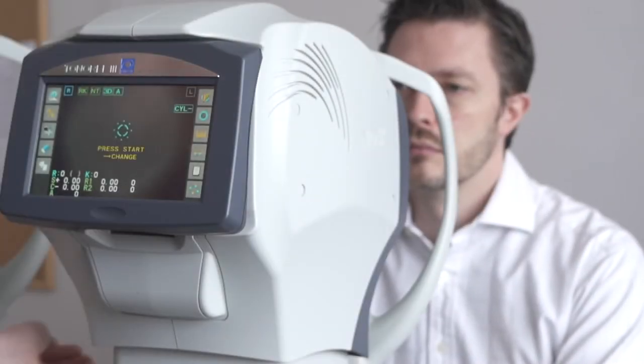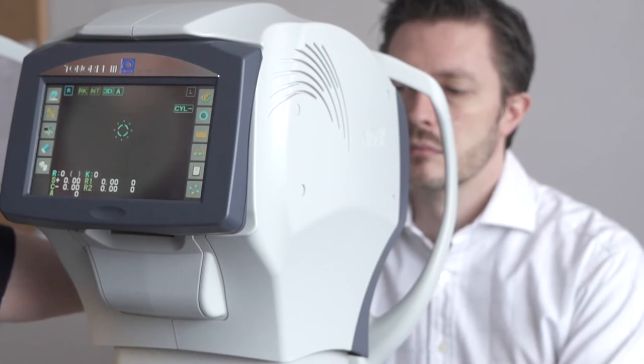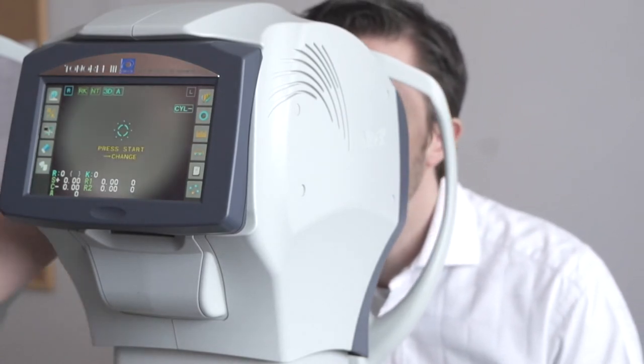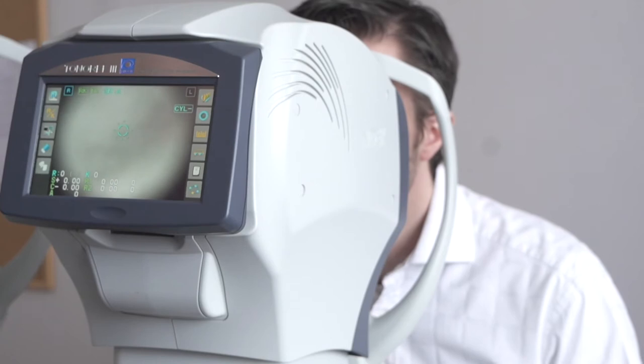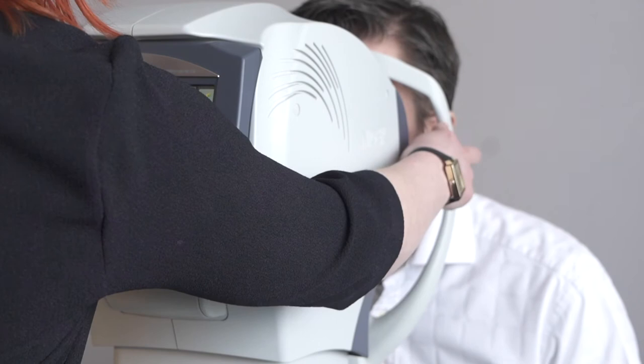The patient should be aligned by asking them to place their chin on the chin rest and forehead against the bar. We're looking to align the outside of the patient's eye with the canthus markers on the sides of the device.